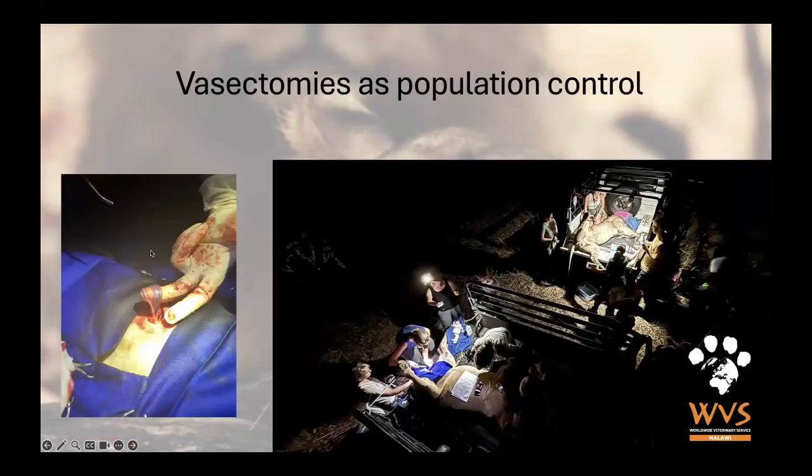And this is a picture on the left. What we do in the vasectomies is we remove a part of the vas deferens. You see the large spermatic vessels on the right, and on the left side is the vas deferens. This is where you remove a few centimeters. And when you close the tunica vaginalis, you can leave one part of the vas deferens out and the other one inside, so there is definitely no chance of them fusing again.